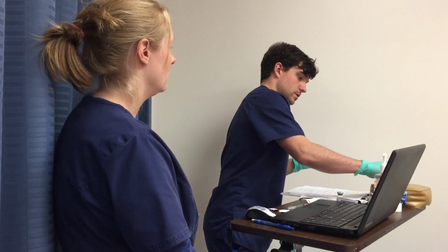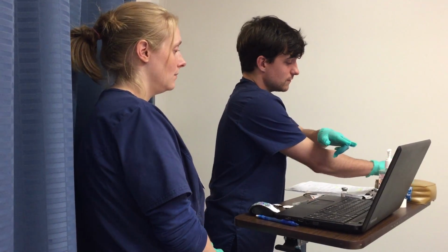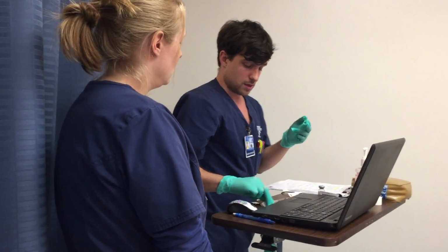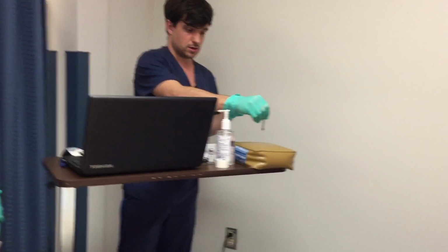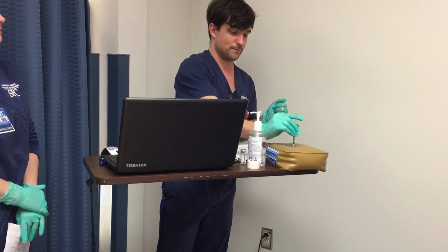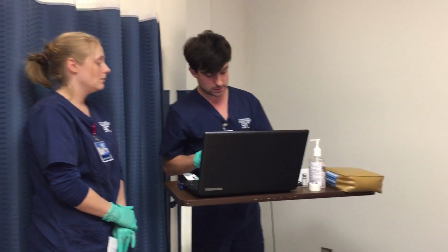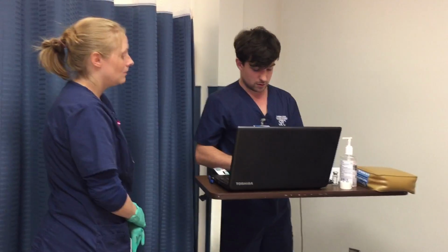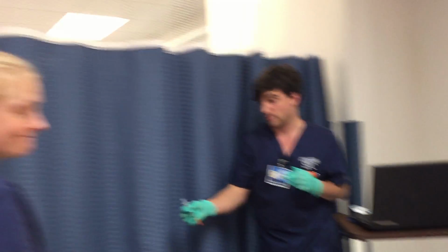So, scrub. We have just checked and verified everything over here. 15 seconds have gone by. And we're going to take this back out. I'm going to go at a 90-degree angle, vertically right down and in. And boop. Okay. Right out. Held for 5 seconds. We're going to make sure that we recap using the safe way, and we're going to dispose of said recap, okay?